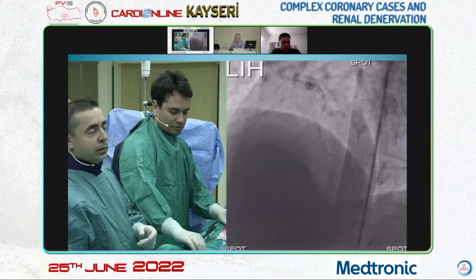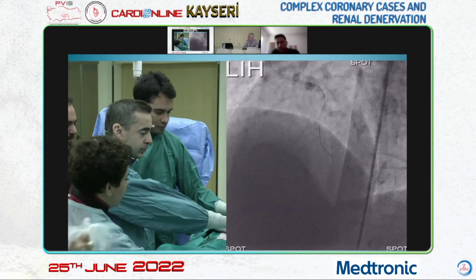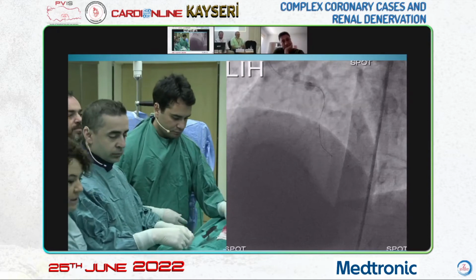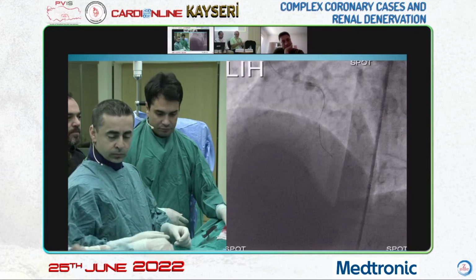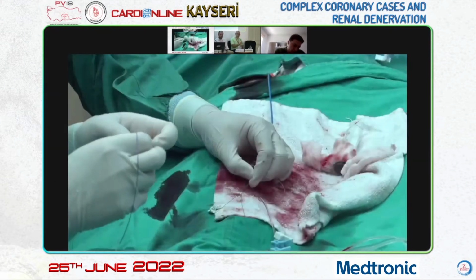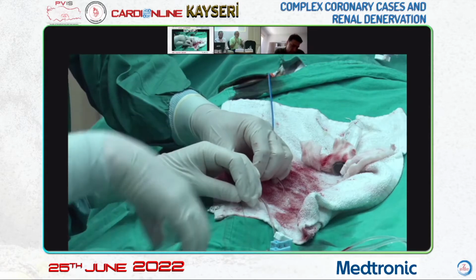I want to add something. In fact, more hydrophilic wires could be used, but here, in my opinion, we are working in this country. If we are thinking of which wire is suitable, it will be good to start with that.